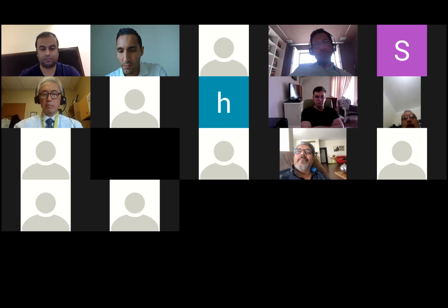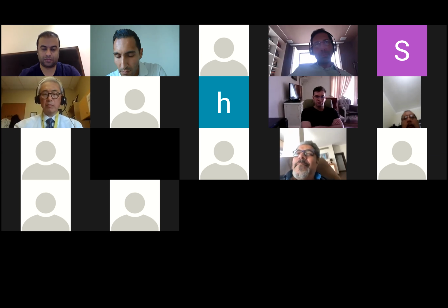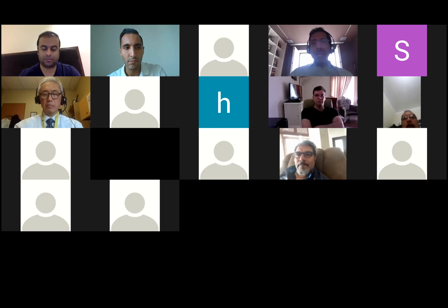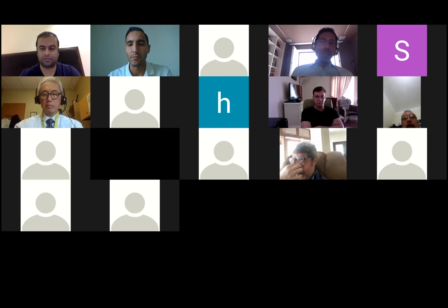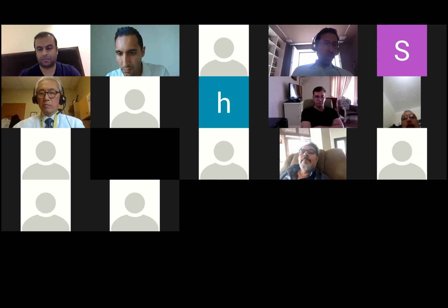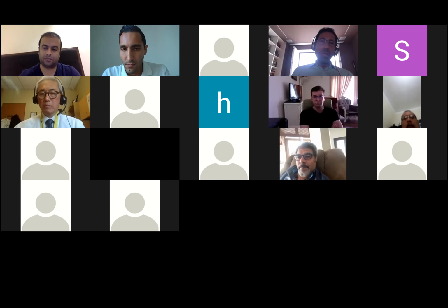Did you face any case of disc misplacement, especially in multiple level cases? It can happen that you don't have a perfectly positioned prosthesis, but migration, mobilization, I never saw that. I had only one case that I had to revise due to infection. I can't remember another need for revision surgery at index level with cervical disc prosthesis.